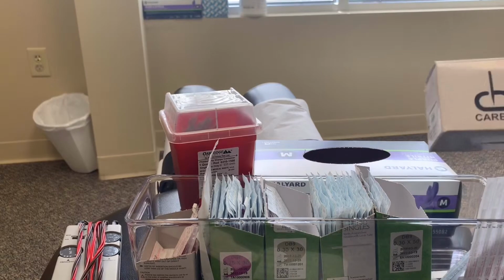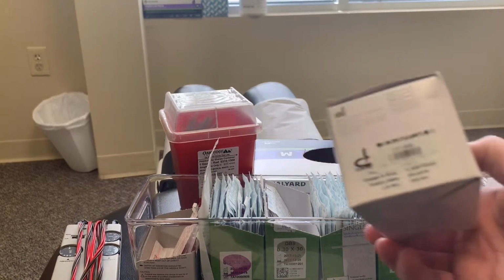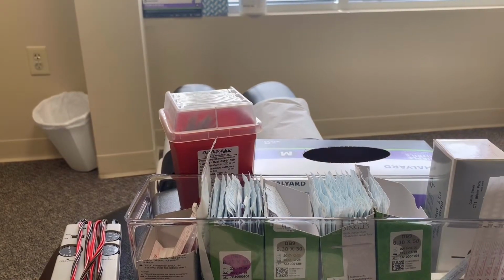And then here's some of the other ones. I think here's a 3x75 again here. And then it just kind of goes down to the smaller ones. So that gives you an idea about the size of dry needling anyways.